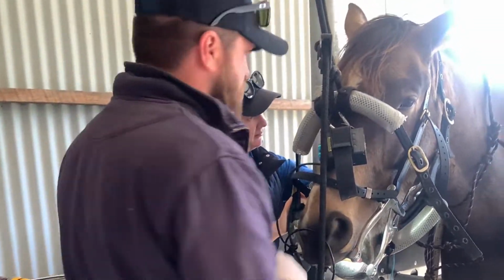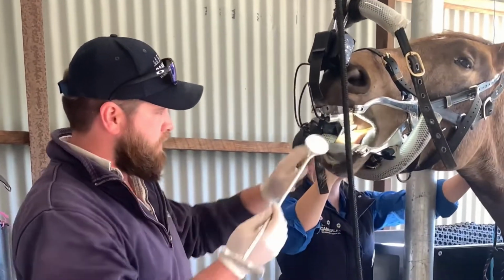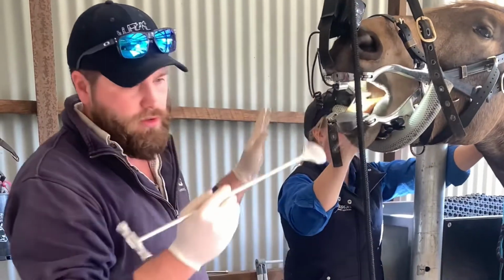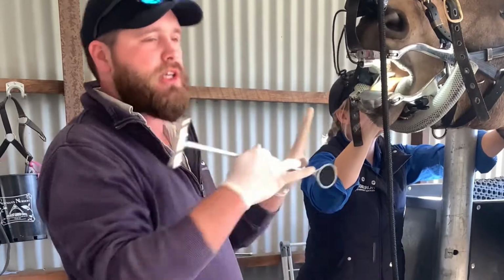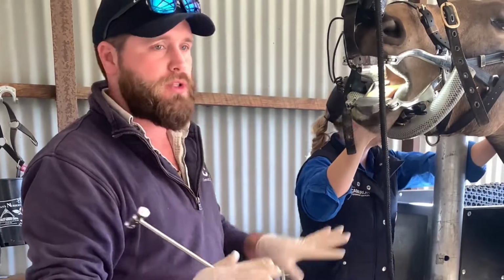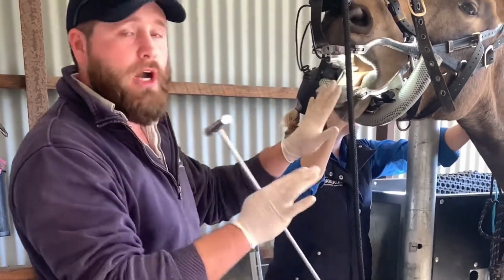Right, so we've had a good look, we've had a look down each of his arcades with our mirror. We've checked all of this horse's mouth. There's nothing to report inside here. And this video isn't really to show you about dental diseases, it's to show you the full process so that we can make sure that we don't miss anything.